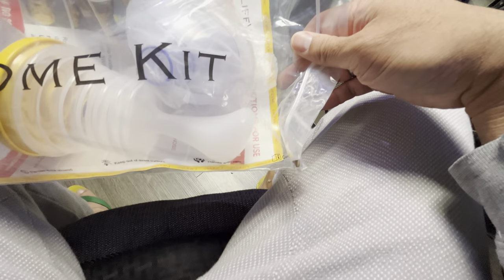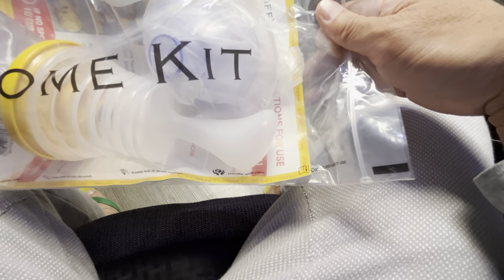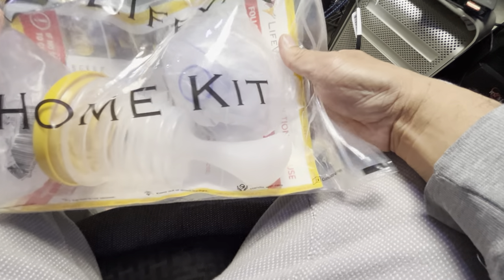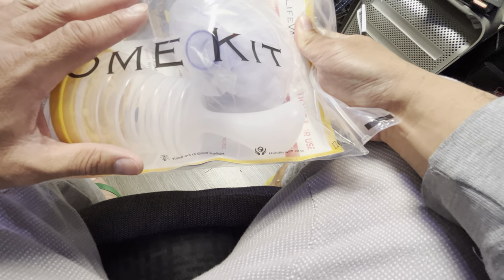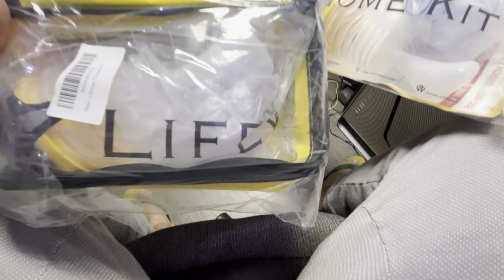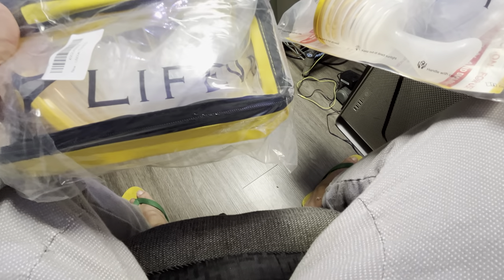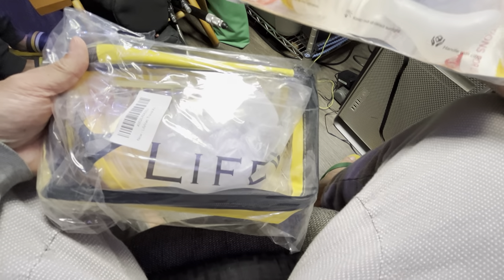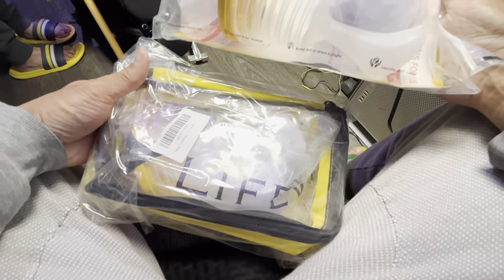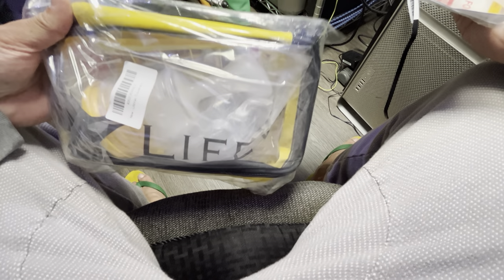So we decided to purchase this for $79.99, and we bought two. This one will stay home in our home all the time, and we have the Travel Pack here. This will go with us in the car, on the airplane, anywhere we go in case of emergency. Now the reason why one looks different from the other is you've got this cool Travel Pack case that holds it in place.